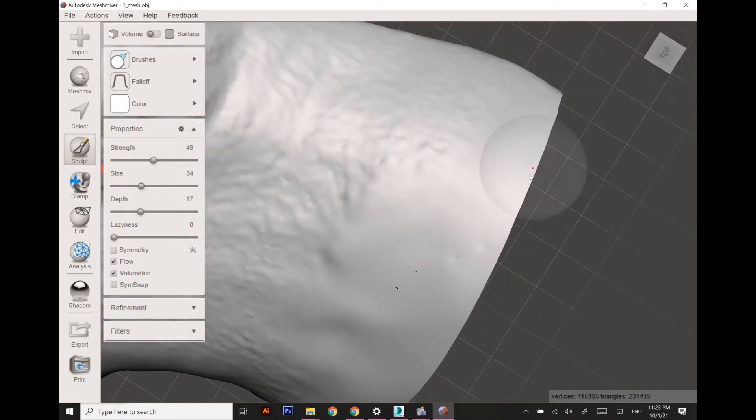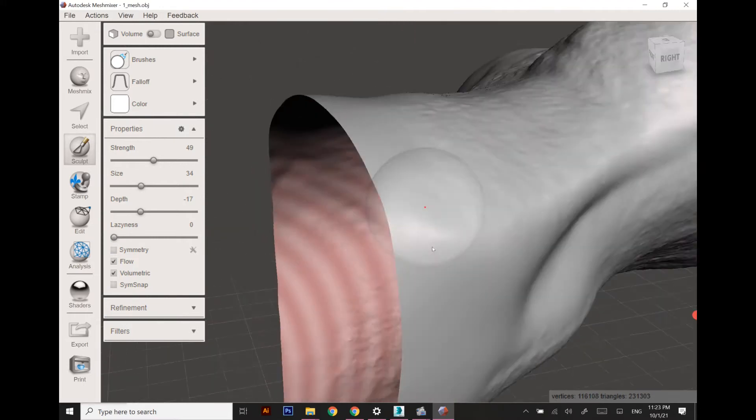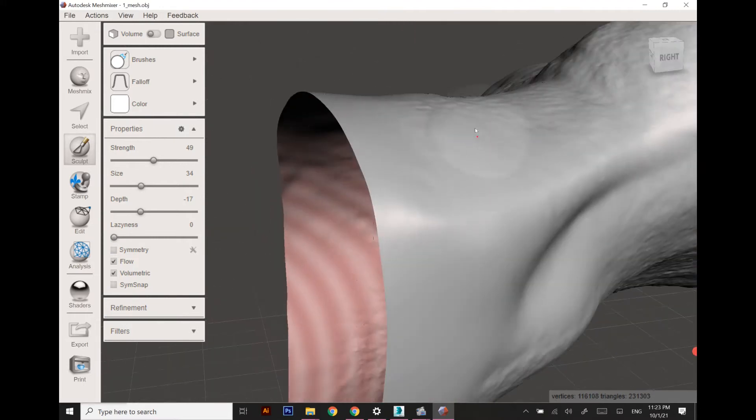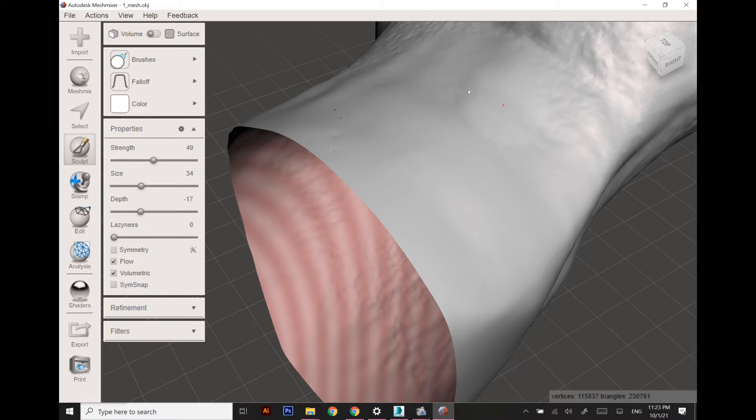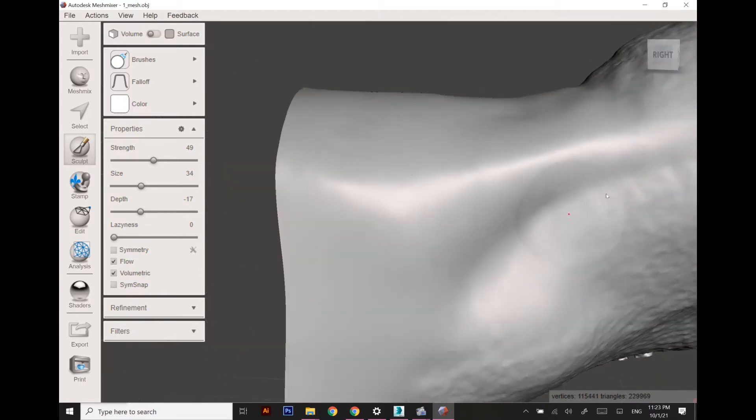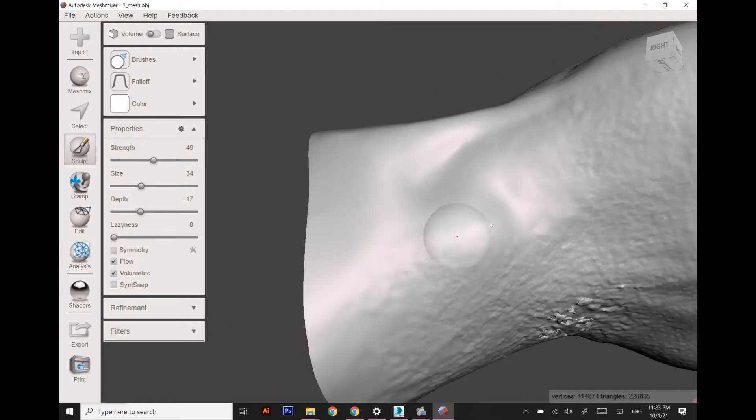These rough areas are going to make a lot of trouble while designing in 3ds Max, so I need to make sure that all of these abnormalities are gone. I'm going to smooth the whole surface.